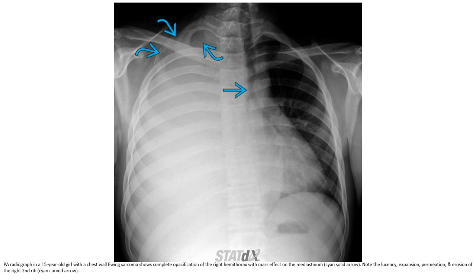This is the chest radiograph of a patient with a chest wall tumor. There is complete opacification of the right hemithorax with mass effect on the mediastinum. Note the lucency, expansion, permeation, and erosion of the right ribs.